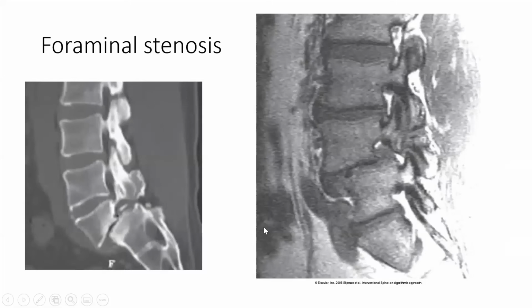Here's a patient with foraminal stenosis. You can see there is a spondylolisthesis between L4 and 5. There's a normal foramen, with a nerve root there in the foramen. Here the disc is rolled up in the foramen, and you can see it on the X-ray as well. It should be foramen there and there. Yeah, the foramen is a little tight space there.